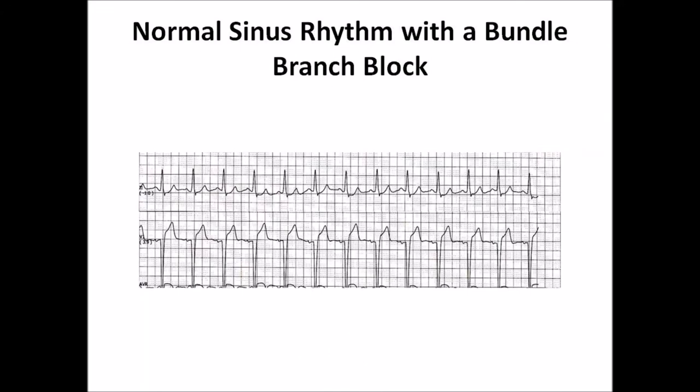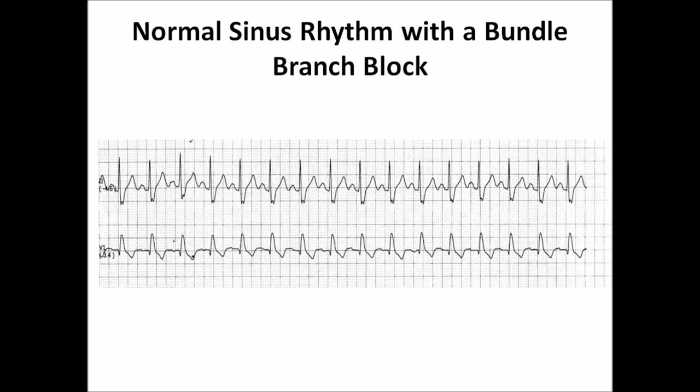The P wave is upright in lead 2 followed by a wide QRS with a QR pattern in V1, at a rate of about 75 beats per minute. This is another example of sinus rhythm with bundle branch block, with the P wave upright in lead 2 followed by a wide QRS and a QR pattern in V1, at a rate of about 93 beats per minute.